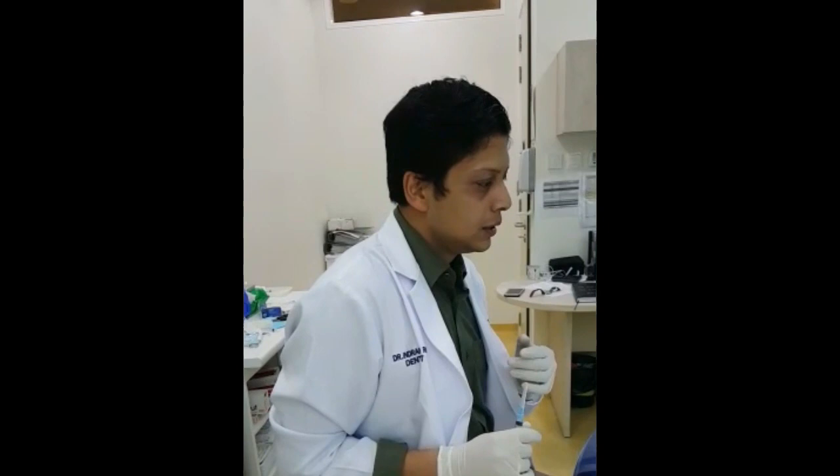Today we are just doing a quick video of the perfect inferior alveolar nerve block. I'll be pointing out a few things which I feel have helped me over the years to give that perfect block.